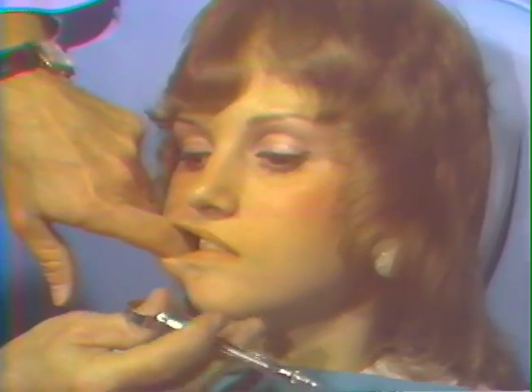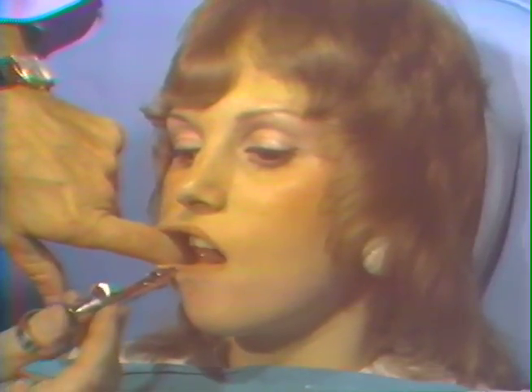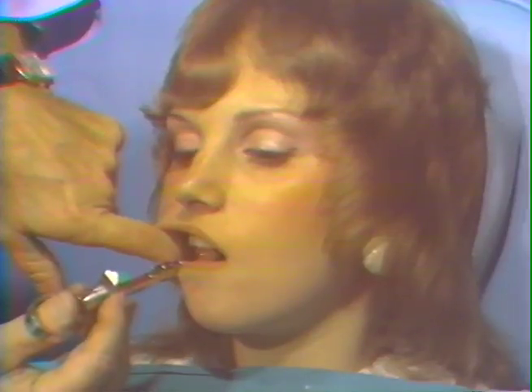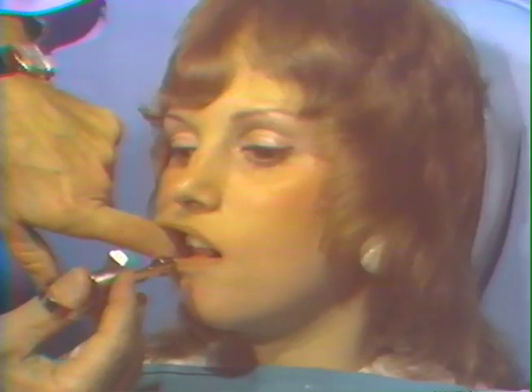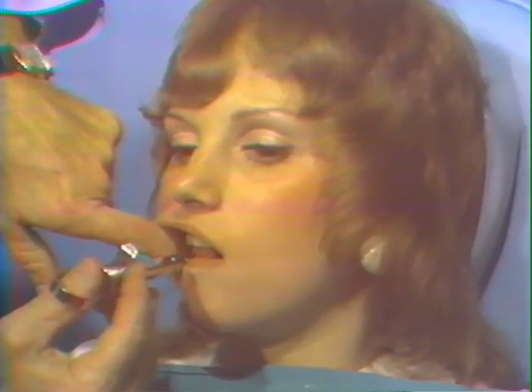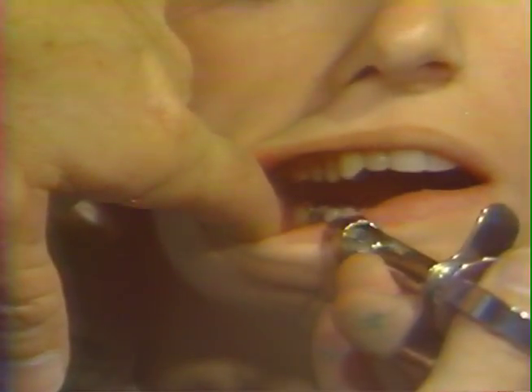For injections of the long buccal nerve, right and left, turn a little bit towards me. Let me pull your cheek out. Don't let me turn your head. Tip your head up just a little bit. That's it, like that. Firm retraction of the cheek is necessary for this injection. Now open a little bit wider. That's the way. The long buccal nerve passes across the anterior portion of the coronoid notch into the buccal groove, and the needle may be placed at the midpoint of the coronoid notch to anesthetize the long buccal nerve, right side.